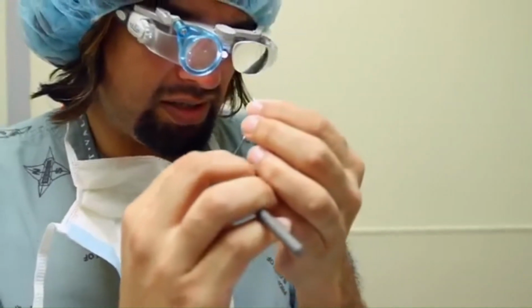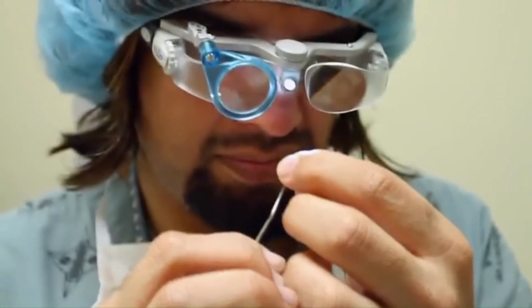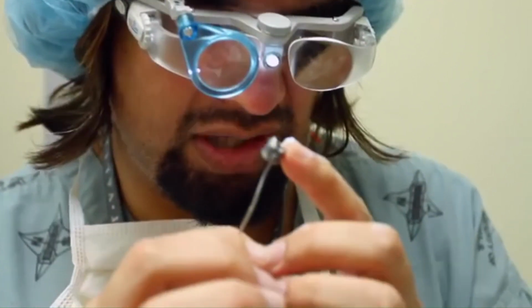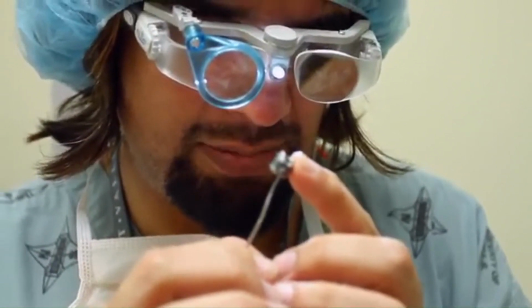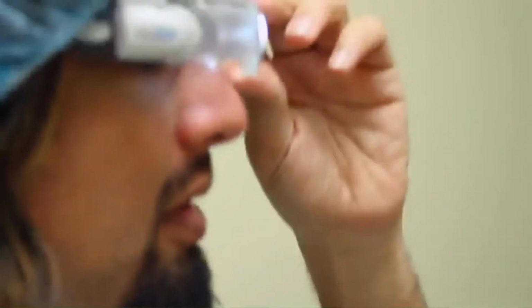Looking through my little magnifying lens, I'm setting the marker to my steep axis here. I can move the magnifying lens out.